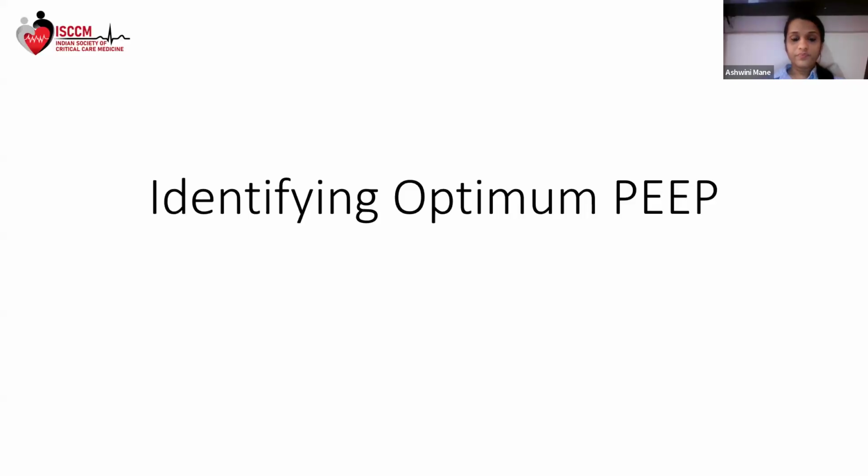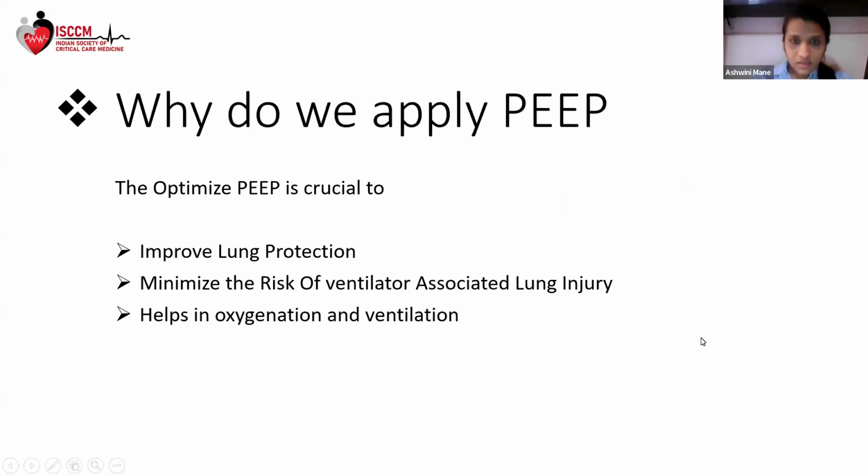Good morning, everyone. So today I'm going to talk about identifying the optimum PEEP. While working in ICU, we are seeing many cases of ARDS, and the one challenge that we all are always facing is how to set the optimum PEEP. So today I'm going to talk about it, and I will try to give the correct answer to this question.